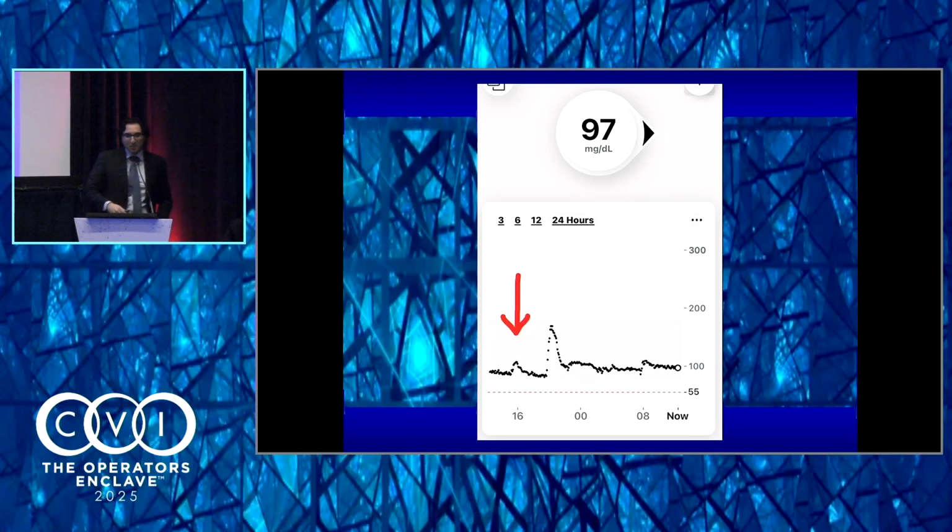And then I just wanted to throw this up there. So interestingly, one of these continuous glucose monitoring companies came to some of the doctors saying, do you want to try it out? I'm sure you've seen it. Patients have a patch on there. They can check their glucose whenever they want. Since I don't go to a doctor, I figured, might as well try it out. Make sure I don't have diabetes.